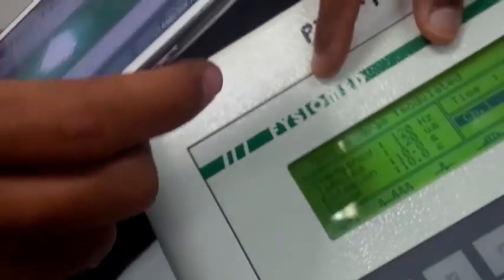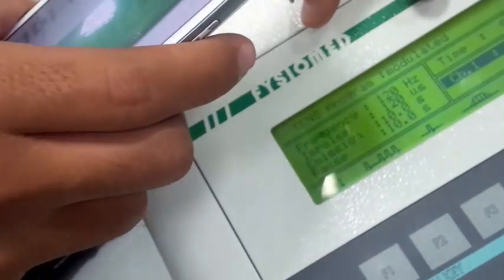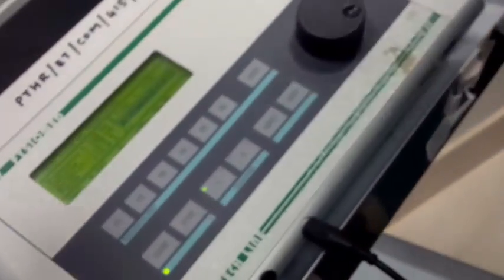So these are all the patterns you have set for one mode, for example modulated mode. But if I don't give any current, the current will not go to the patient. So how many milliamps can I give for TENS? For this type, in general, 1 to 100 milliamps. You can increase. That is the range you can go.